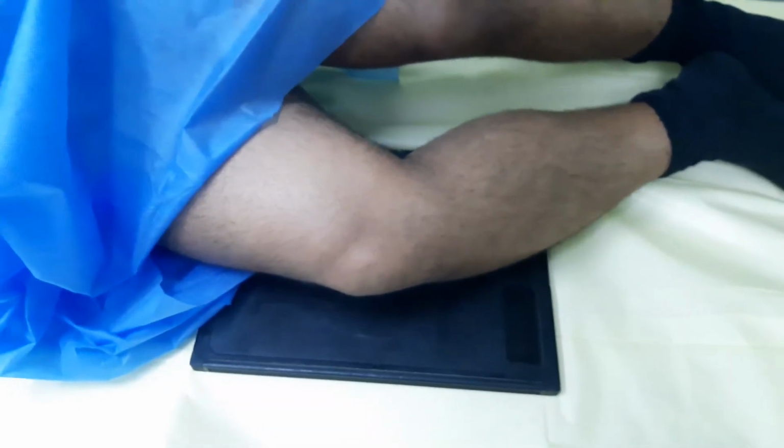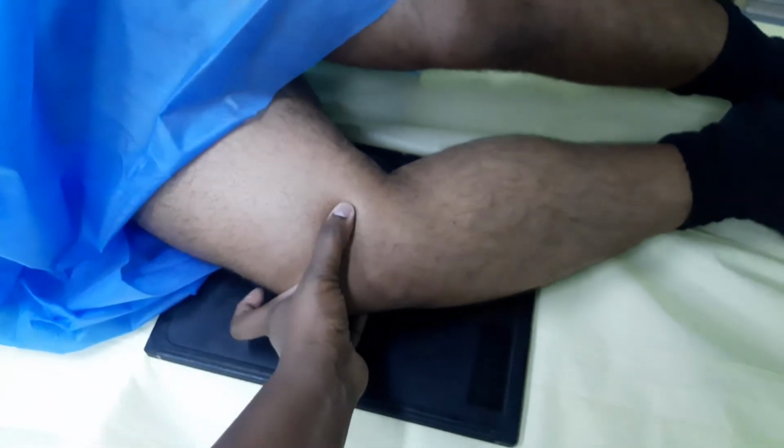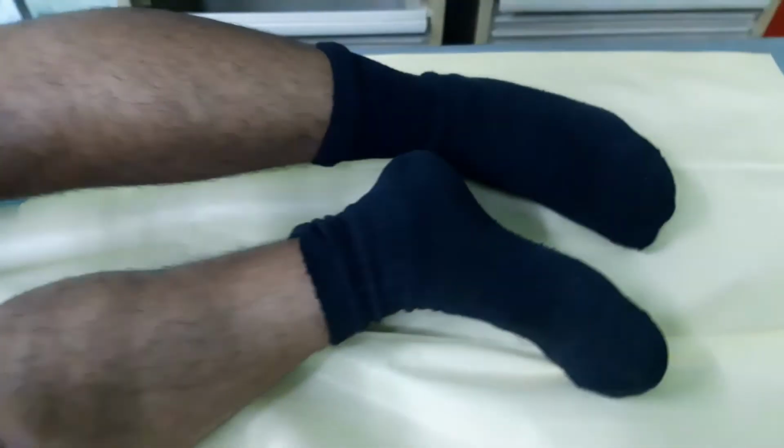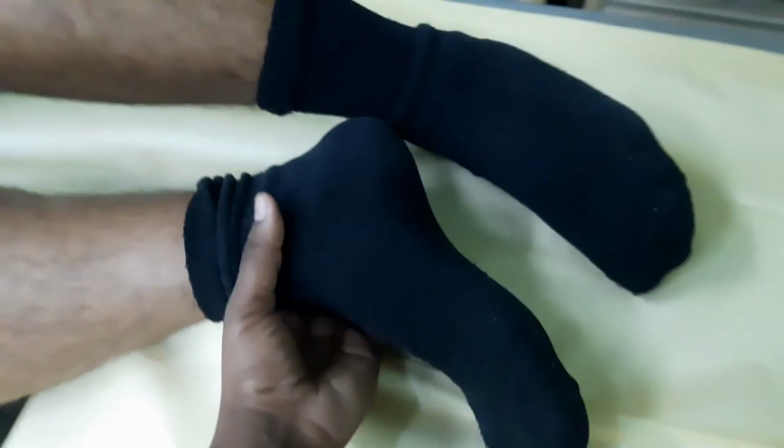Another thing you can do is palpate for the patella. And when you hold here, you make sure that both tips of your fingers line up under each other, right? Now, the thing with this, if your patient is coming in with a potential or a suspected patellar dislocation, palpating for the patella is not going to work, because when you palpate the patella, if dislocated, it will be off to one side. So you'll actually either end up being under-rotated or over-rotated. Right, so the condyles is the safest bet.